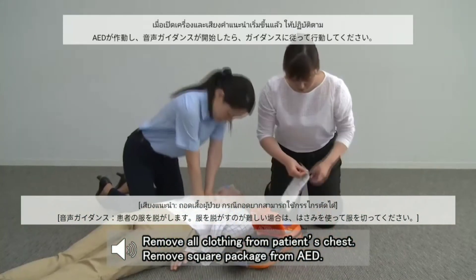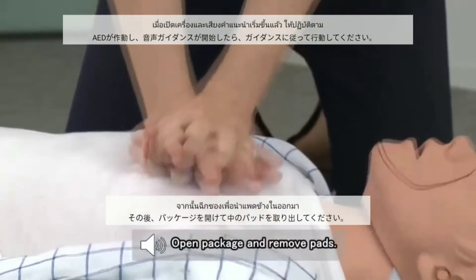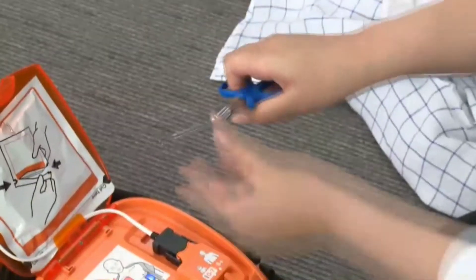Operate the AED according to the voice instruction. Do chest compressions at a rate of about 100 to 120 times per minute.